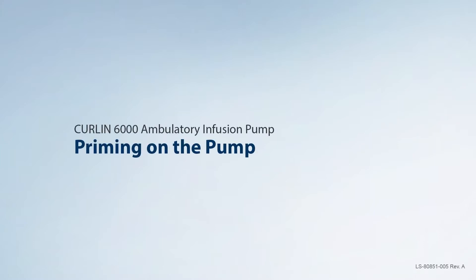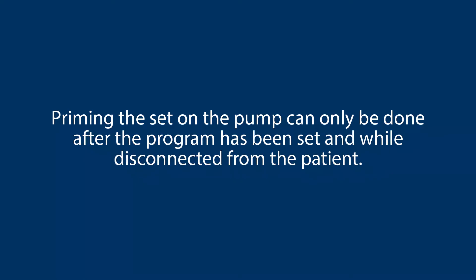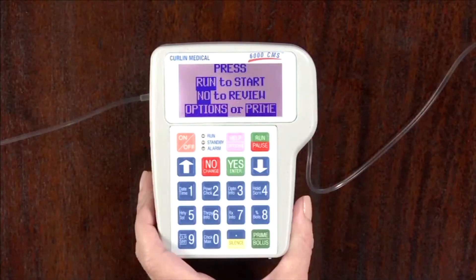Priming on the pump. Priming the set on the pump can only be done after the program has been set and while disconnected from the patient. While in the run screen to prime, select the prime bolus key on the bottom right of the pump.